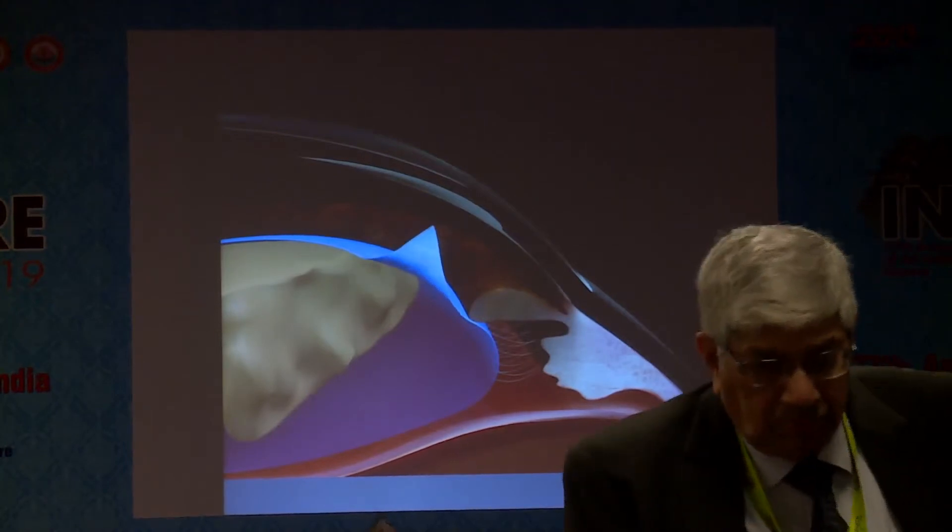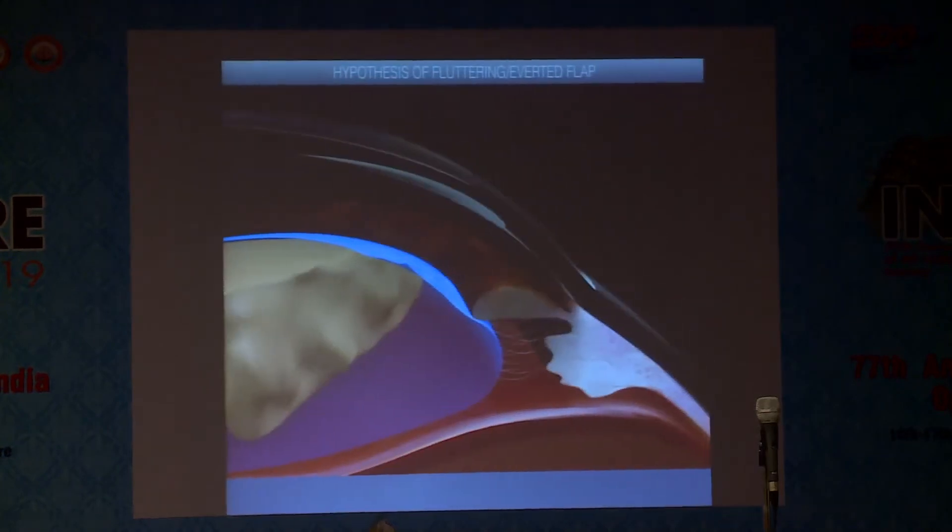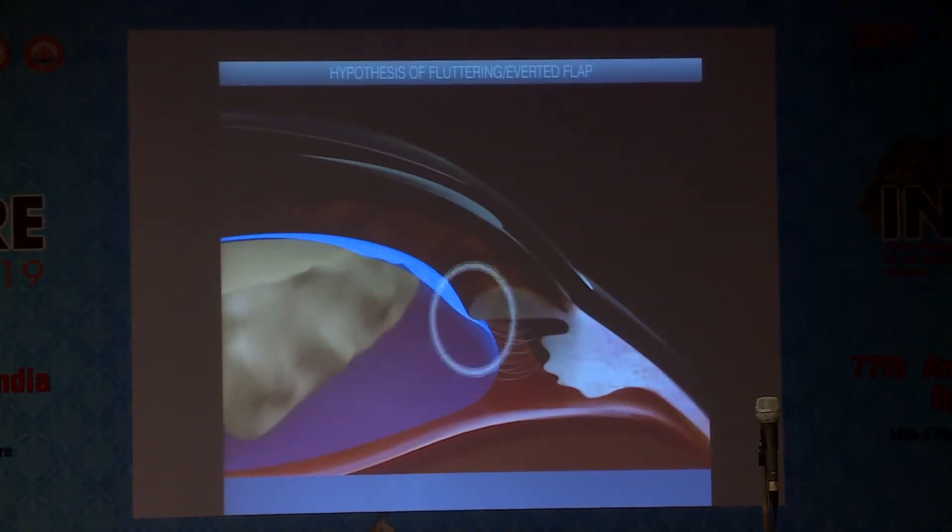Why does this happen? It simply happens because the end of the flap has a short arm that becomes responsive to the fluidics in the anterior chamber. When it becomes responsive to the fluidics, it flutters. Had it gone beyond the equator, it would not have fluttered. So that end point acts as a pivot around which it rotates or flutters.